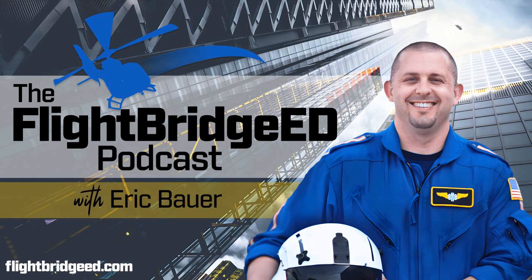So what I like to do is rule out a bundle branch block right away, because that's our main mimicker that we could see. And so what I do is I go straight to V1, and they've shown through research and trials that V1, which is your first septal lead, is diagnostic for a bundle branch block. So I'm going to look at my QRS duration on my measurements on my 12 lead. You remember, if you don't have that, you're going to count your little boxes. So greater than 3 little boxes for your QRS segment is going to be pathologic.